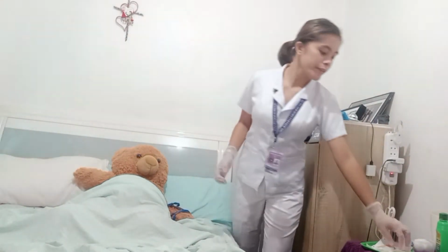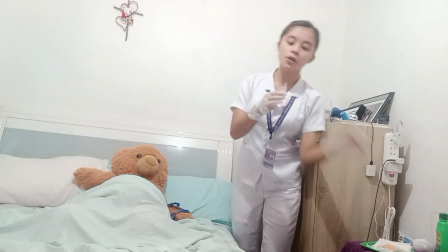So now grab the syringe and remove the cap. So hold the syringe between the thumb and the forefinger of the dominant hand with the bevel of the needle pointing up. So now stretch the skin taut of the injection site by pulling gently with the thumb and forefinger of the non-dominant hand. So this provides an easy entrance into the intradermal tissue.